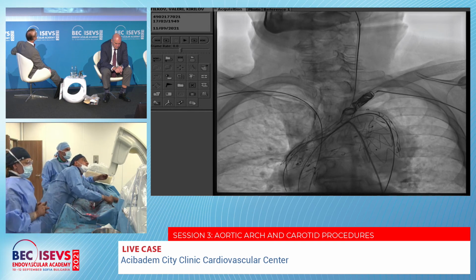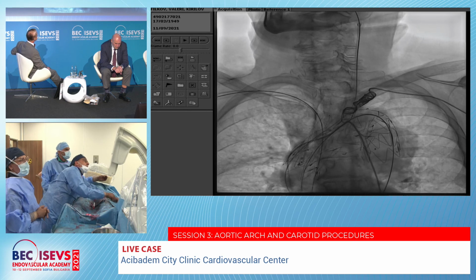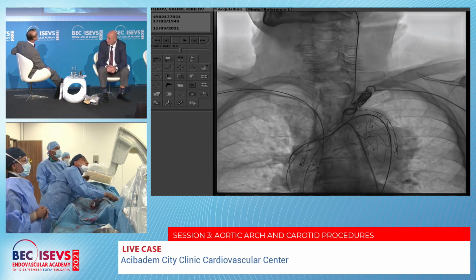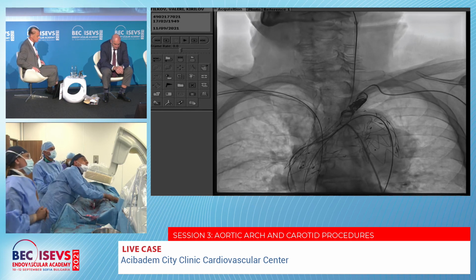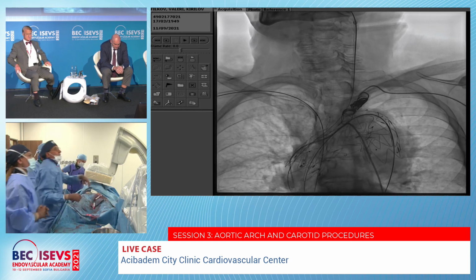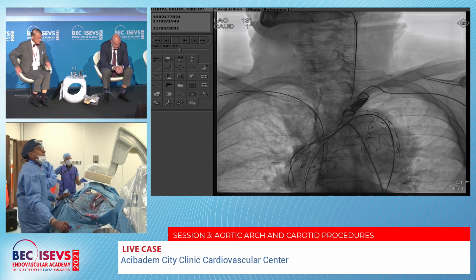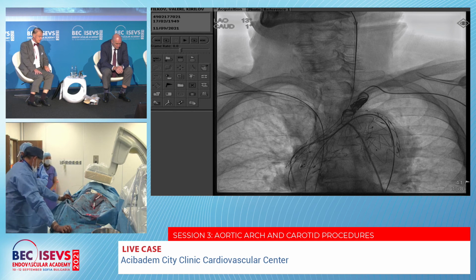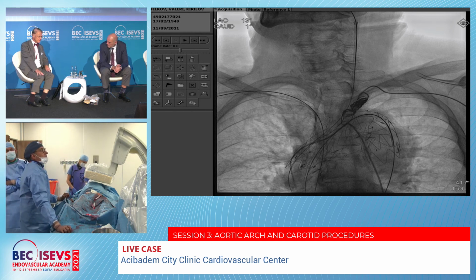And I would leave it as it is. Yes, because I think it's most probably enough, but we can check. Okay, yes, Valeria also recommends to check on it. I have the impression it's enough.